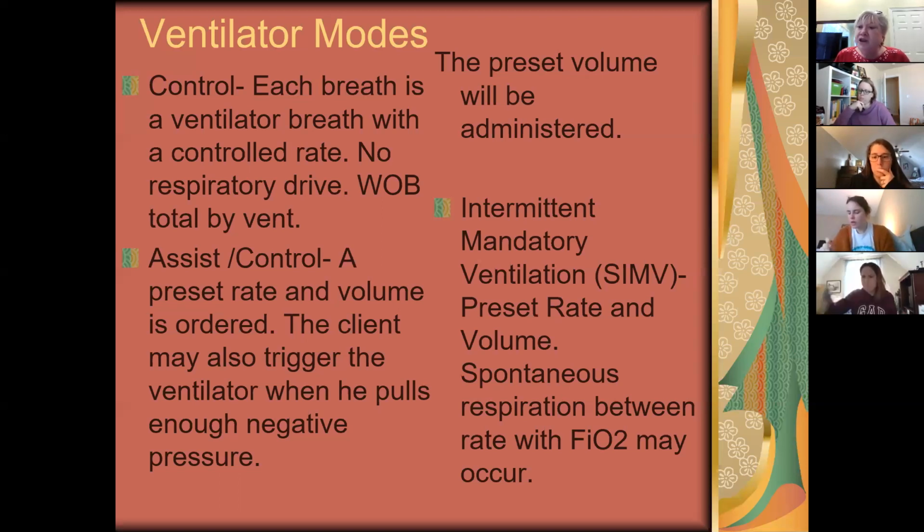And it's really up to the human that's following this patient to say, you know what? They got 16, but they're actually breathing 24. Do they really need that 16? So maybe they're on the wrong mode. I mean, that would be for us and the smart people of it to say that we're not doing it right. We wouldn't let that go on for a really long time. You see what I'm saying?